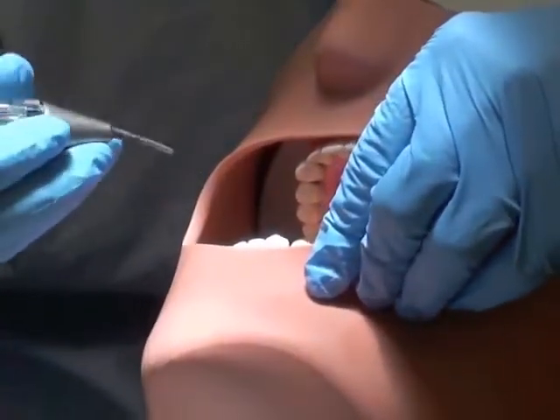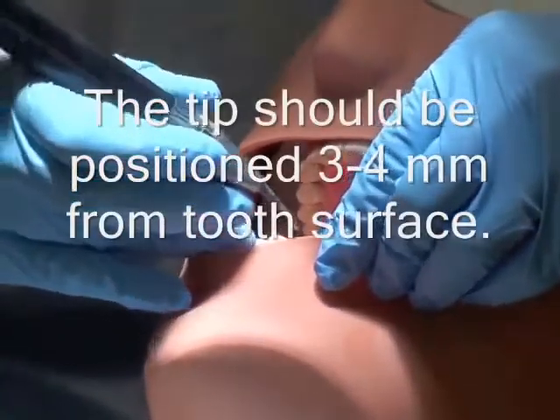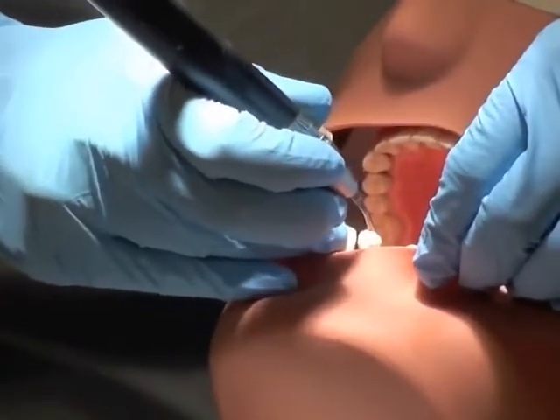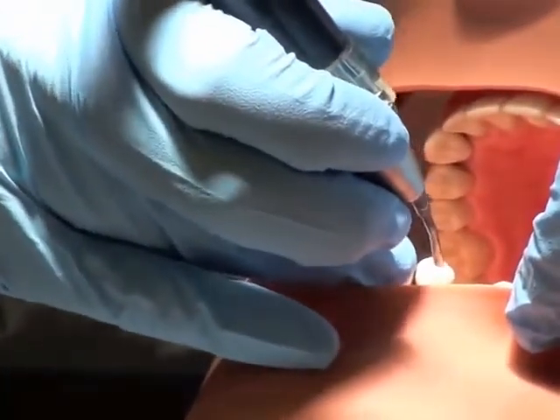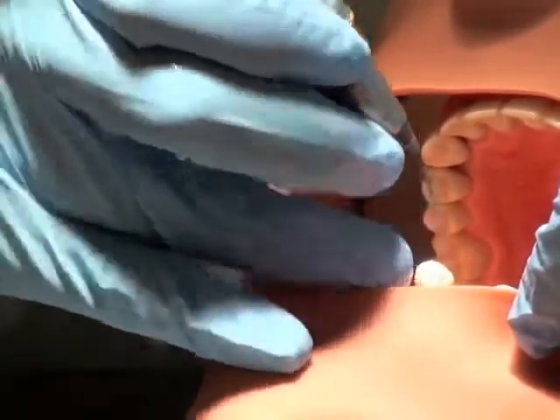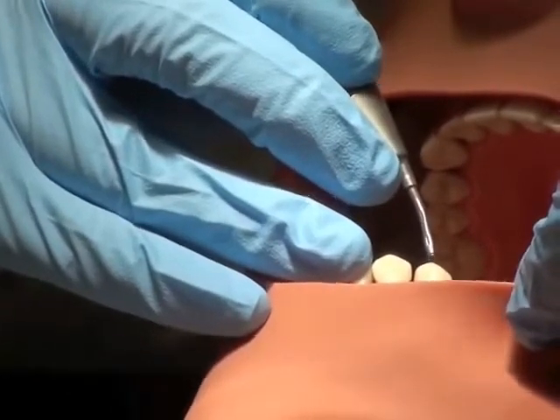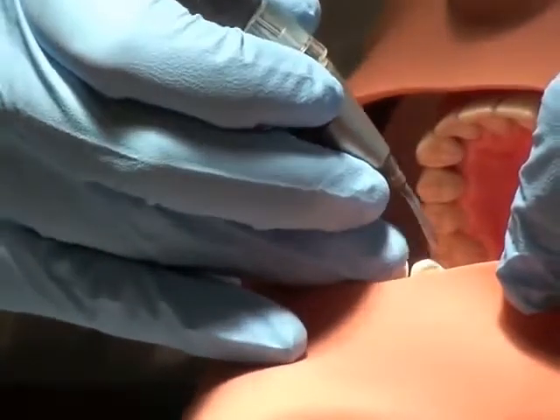The ProfiJet is used for extrinsic stain, and the placement of the tip angle is very important. For buccal and lingual, the tip is positioned at a 60-degree angle towards the gingiva. For the occlusal surface, the tip is positioned at a 90-degree angle. It can be uncomfortable for your patient if you position the tip incorrectly.